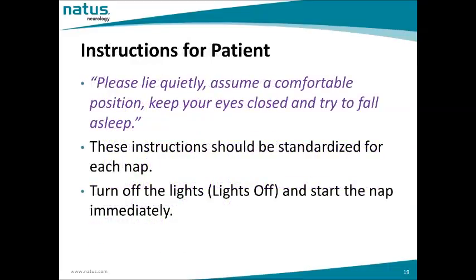The instruction for the patient should be standardized for each nap. The example here is, please lie quietly, assume a comfortable position, keep your eyes closed and try to fall asleep. This instruction should be standardized for each of the naps. Turn off the lights, that means lights off, and start the nap immediately.